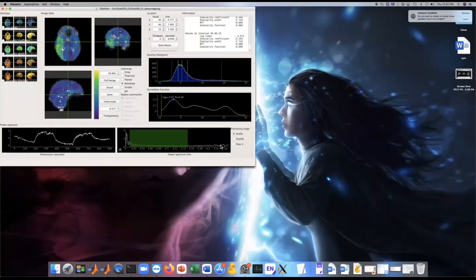Lastly, and very importantly, we should always look at the regressor. If you look between pre-filtered, which is the initial estimate, and the pass 1 estimate of the regressor, there's a huge difference which is based on the filter we used, which you see in the shaded green area here. So if we blindly use software, we might miss some important parts of the data.